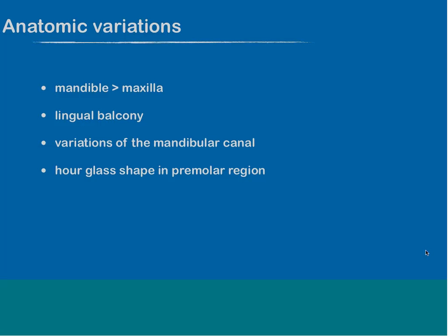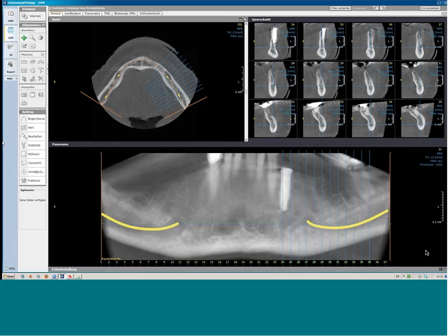Maybe you've seen that as well in some images, but this is a very rare condition. So just look for changes in the mandible. And once again, I show you this balcony here in a different patient.